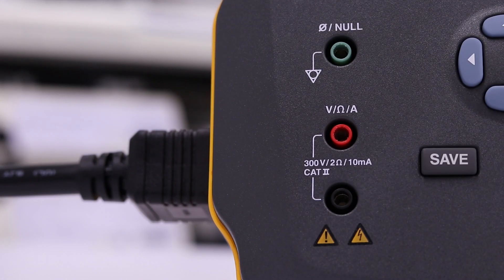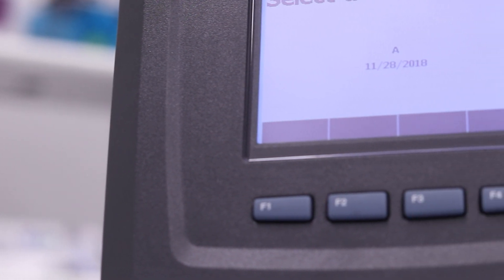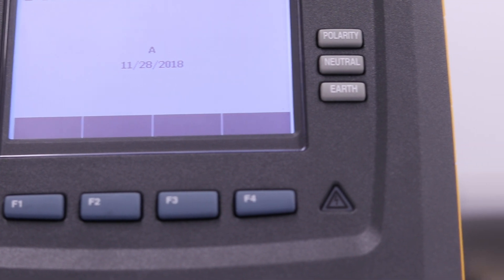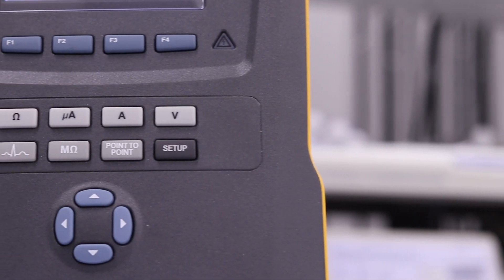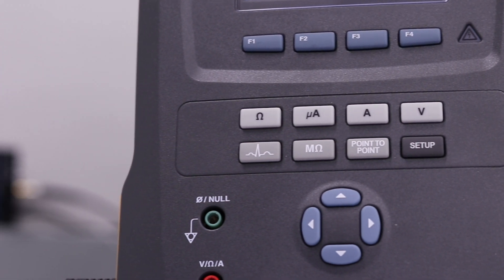More specifically, testing with the Fluke Biomedical Electrical Safety Analyzer, along with several other accessories. The GI-4000 electrosurgical generator is classified as a Class 1 Type-CF medical device, according to the IEC, complying with the highest degree of protection against electrical shock.